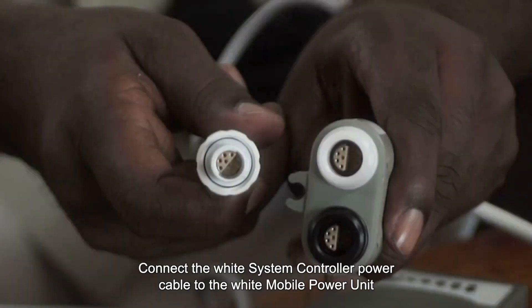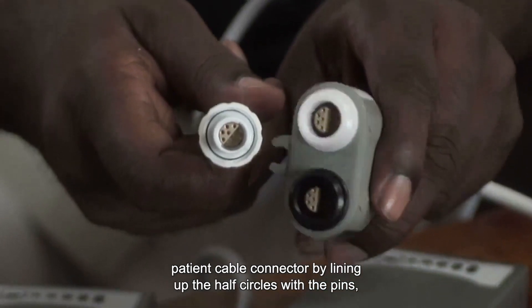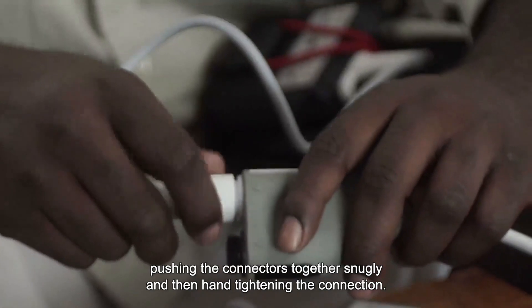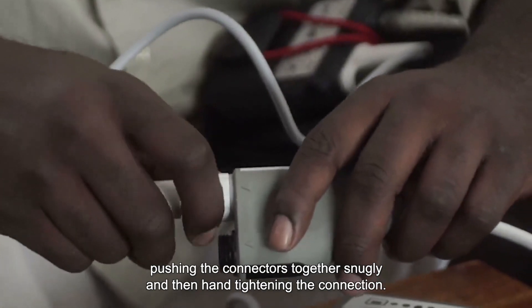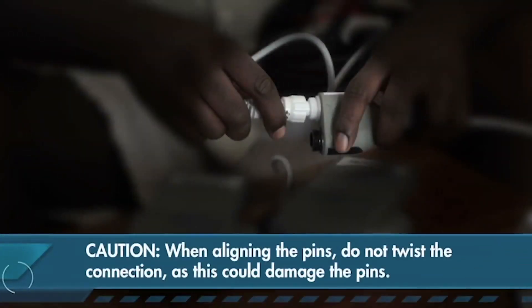Connect the white system controller power cable to the white mobile power unit patient cable connector by lining up the half circles with the pins, pushing the connectors together snugly, and then hand tightening the connection. The alarm will stop. When aligning the pins, do not twist the connection as this could damage the pins.